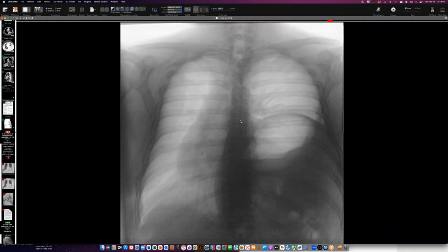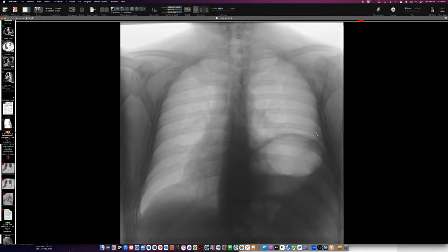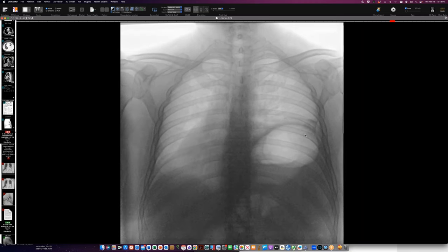When he sniffs, you'll see that left side jerks upward — it's going up while the other one goes down. On the lateral view, he is able to resist most of the paradoxical motion posteriorly, so there is some muscle function posteriorly. It's the dome that jumps up more — this indicates relative weakness. Paradoxical motion does not equal paralysis; it just indicates the diaphragm is not as strong as other parts.